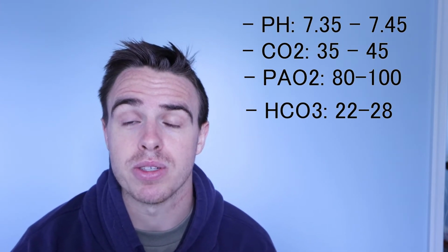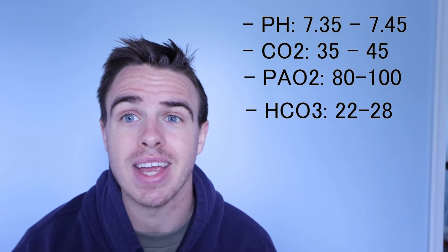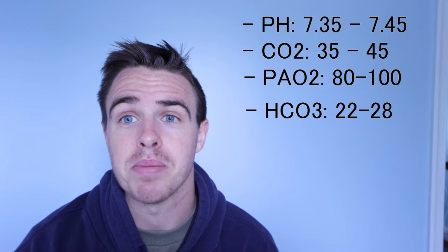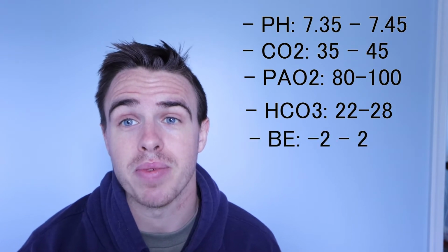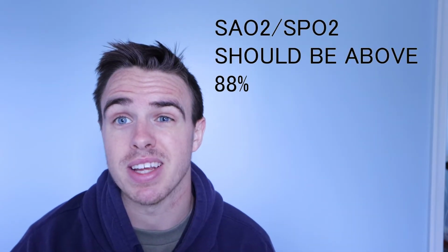So then we also want to look at the bicarb. The bicarb should be anywhere from 22 to 28. And then we also want to look at the base excess. This should be anywhere from -2 to +2. And then with oxygen saturation, we want this to be above 88%.